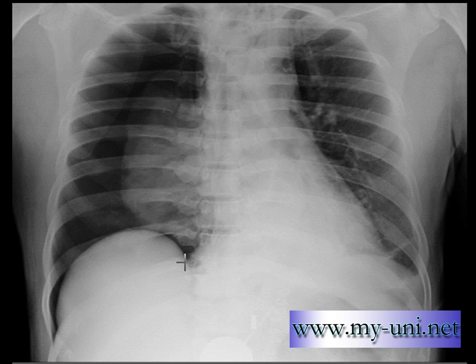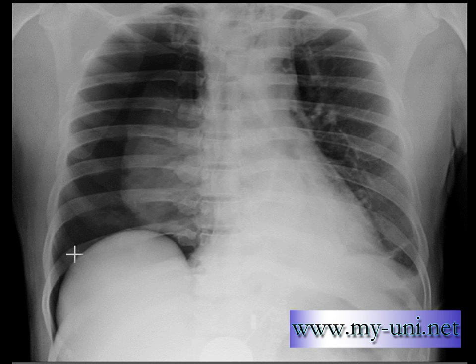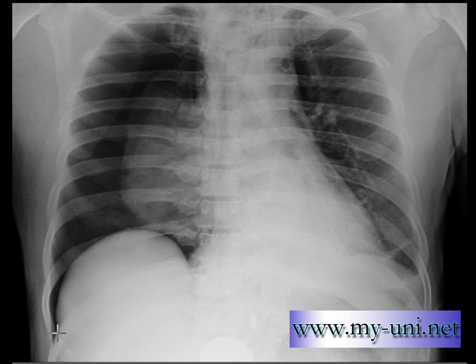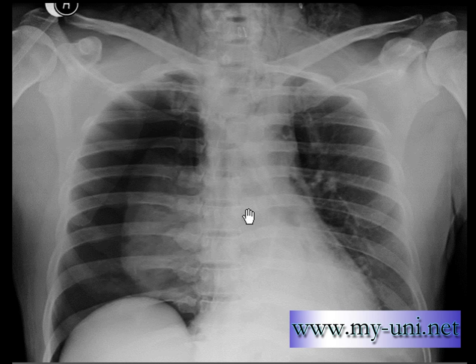Another reason to believe that this is a pneumothorax: you have pencil-sharp margins of the right hemidiaphragm, and the air density is going too far down. A normal hemidiaphragm should not be that steep — it should not make such an acute angle. Moreover, I believe that this is a supine X-ray, though the X-ray does not mention whether it's supine or erect.